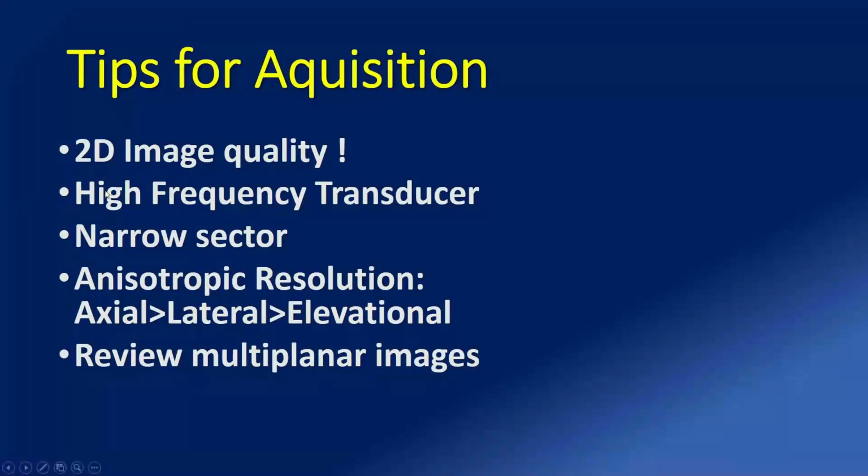And we need high frequency transducers, so that's why we need to push companies to provide us better 3D probes in order to obtain the highest frequency we can. We need to use a narrow sector, and we need to remember that 3D echocardiography has an anisotropic resolution.